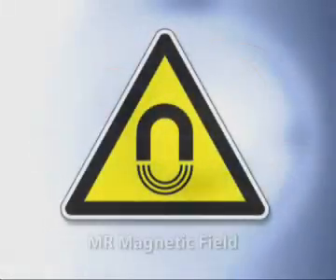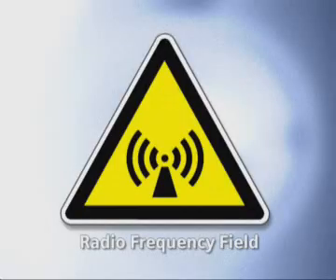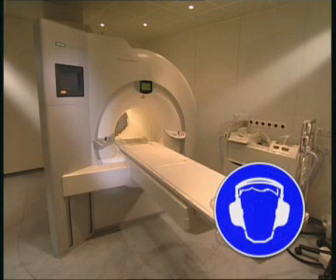The static magnetic field used in MR does not cause any lasting side effects. The same is true for alternating fields when used properly. The rapidly switched magnetic field gradients in combination with the static main magnetic field are the cause of the considerable acoustic noise created during an MR examination.